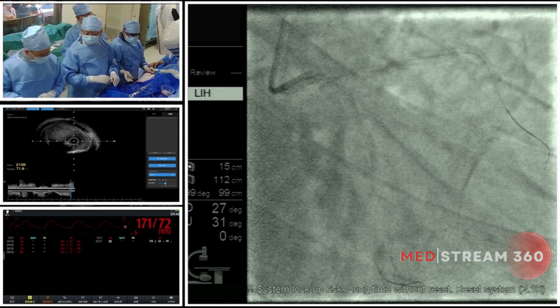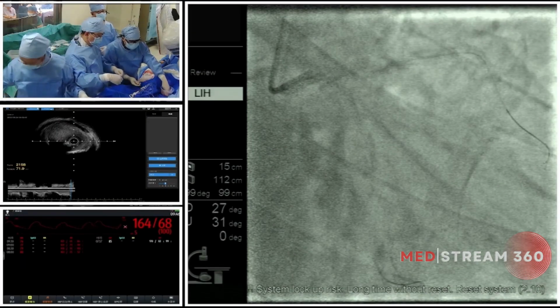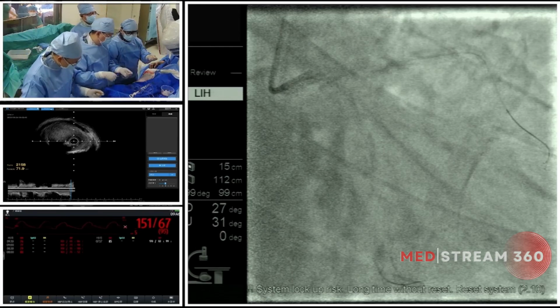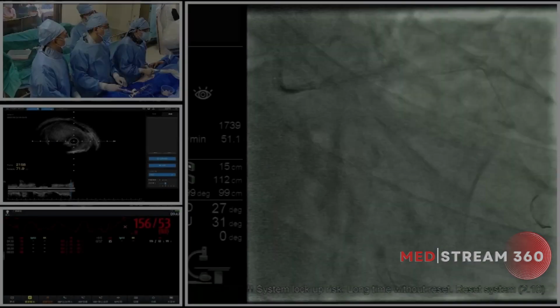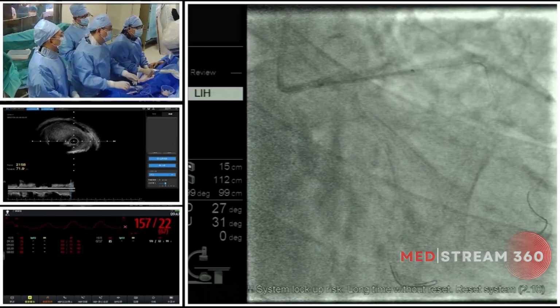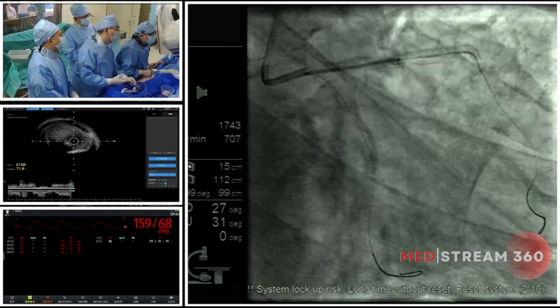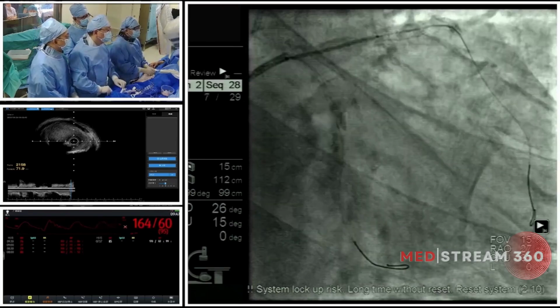after rota and IVL, calcified plaque fractures were significantly greater in number after IVL compared with RA. But the use of RA was associated with a greater acute lumen gain.